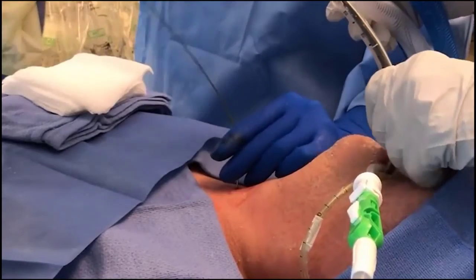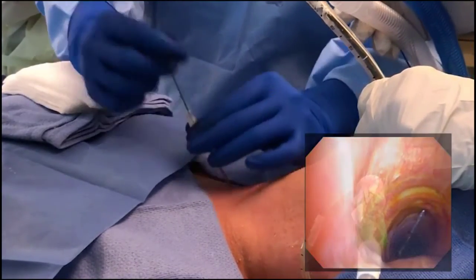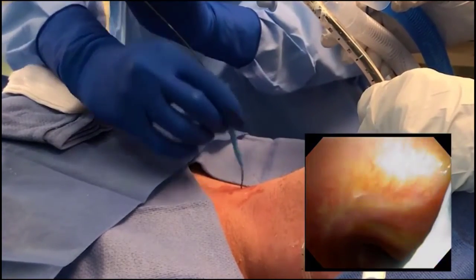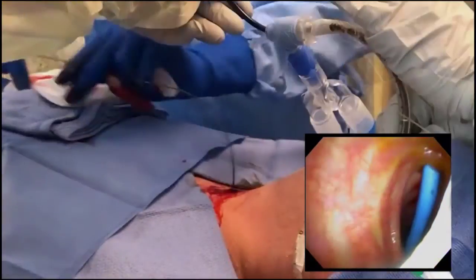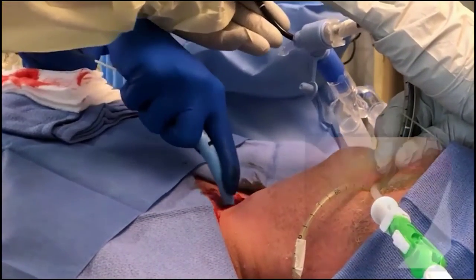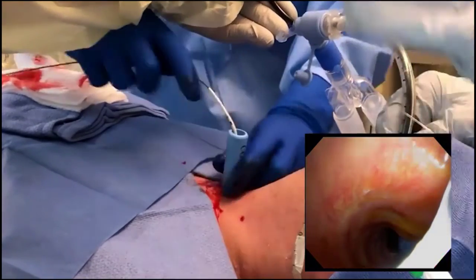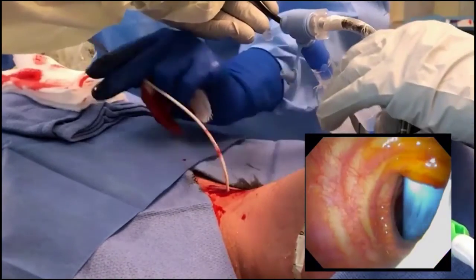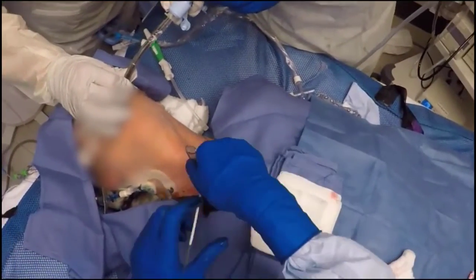Feed the guide wire through the needle and visualize it while advancing it distally toward the carina. Remove the needle over the wire, keeping the wire in the trachea at all times. Advance the small tracheal dilator over the wire to dilate the tract. Remove the small tracheal dilator and advance the single-stage progressive dilator over the wire with the protective sheath loaded. Remove the progressive dilator, keeping the wire and protective sheath in place.